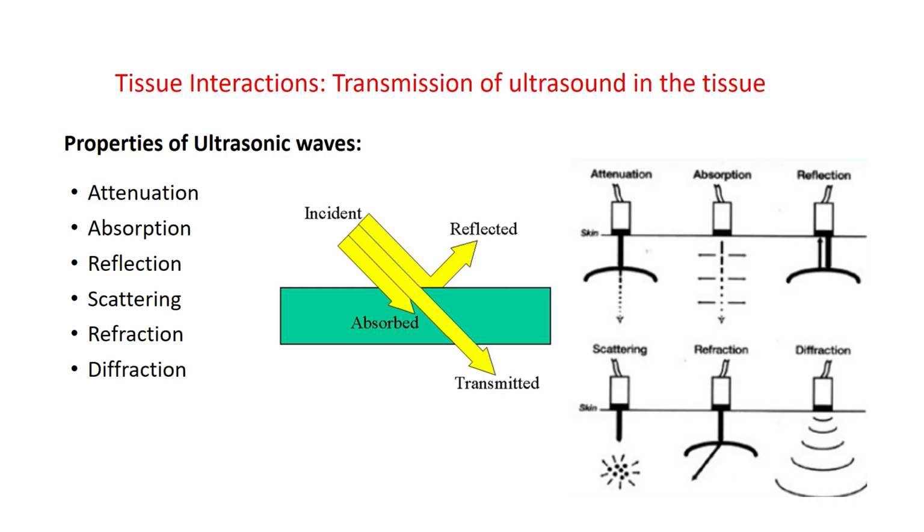Absorption of the ultrasound in the tissue during scanning is generally used in therapeutic ultrasound.